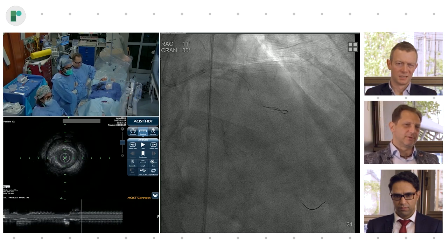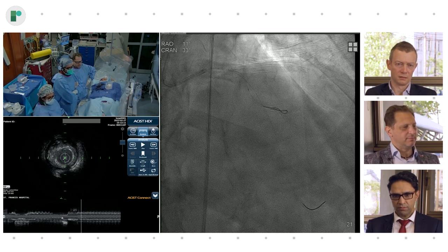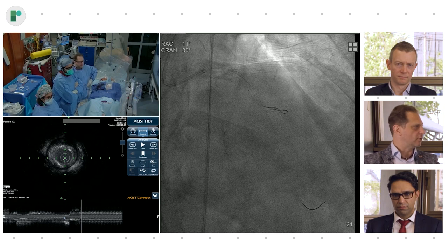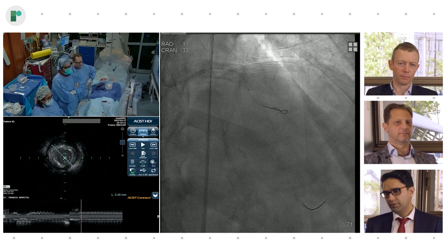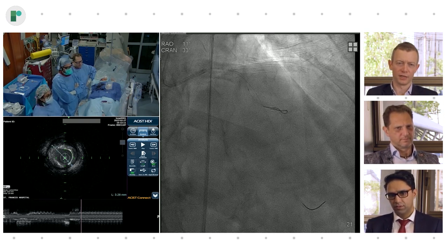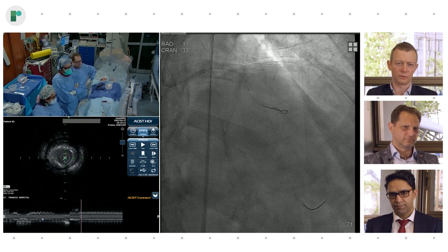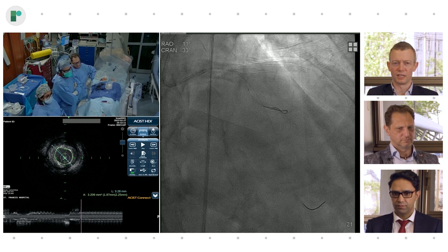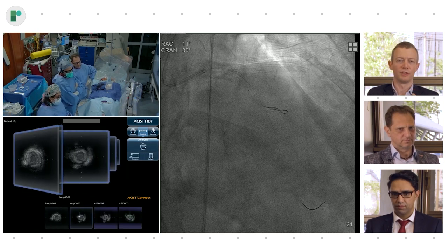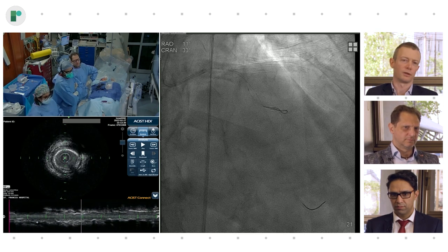So I think ultimately what you have to do is maybe put a smaller stent distally so you don't dissect distally, and then make sure you use a stent platform that you can bring up to much larger sizes. A couple of things are crucial, right? If you do the IVUS pullback in the first initial pullback, first you find your landing zones proximally and distally, but the second, perhaps more important thing is to look at the morphology of the plaque. We just saw it went quite quickly, but there are no severe calcifications, right? So this is the first step in the imaging, which will help you decide whether or not you need to do any predilatation, scoring, cutting balloons, rotablator, and so on.